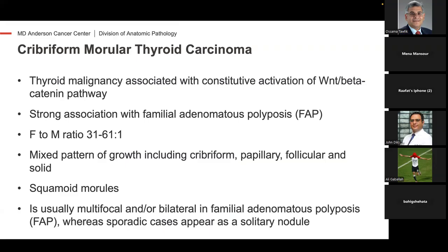Very rarely that would be the first presentation in a patient with FAP. Very strong female to male ratio, so it's 31 to 61 to 1. You have mixed growth pattern like we saw. It's cribriform, papillary, follicular, and solid. And of course, you see the squamoid morules. And I think those squamoid morules lose TTF1, and I think they also lose keratin.